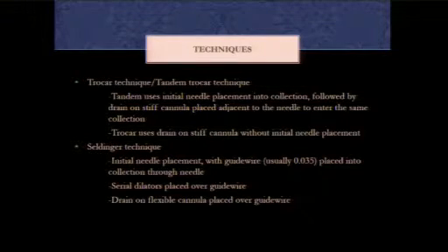You can use the tandem technique, which is similar to the trocar technique. You just put a needle in first to confirm that you're in the collection, and then you put your catheter on the stiff trocar into the collection adjacent to your needle.